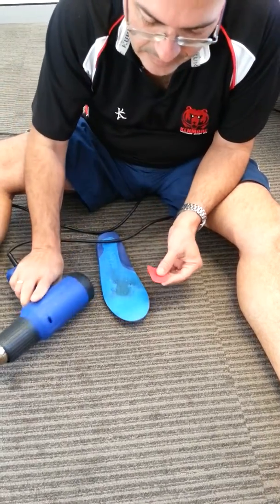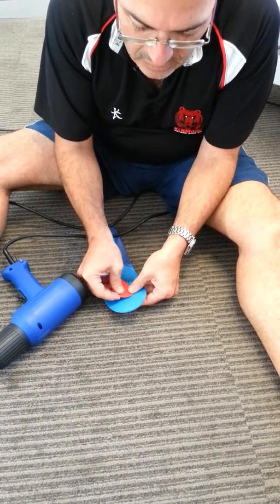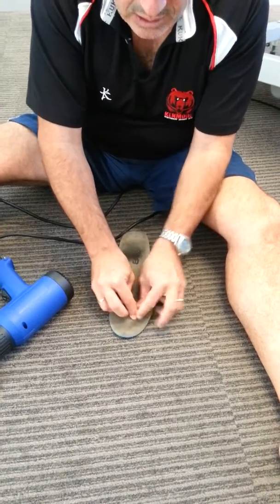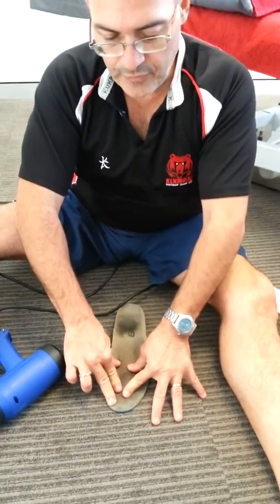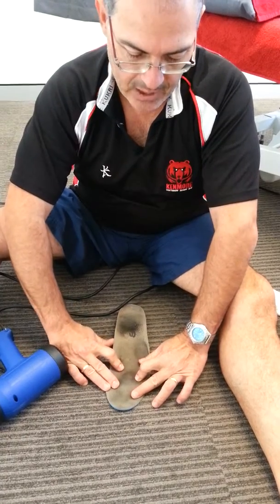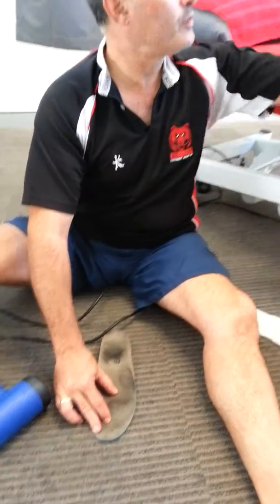That's melting nicely. We'll just pop that in there and then we'll just seat it down so that the orthotic holds the mould. We'll stick that in with some really sticky adhesives that come supplied with these orthotics.